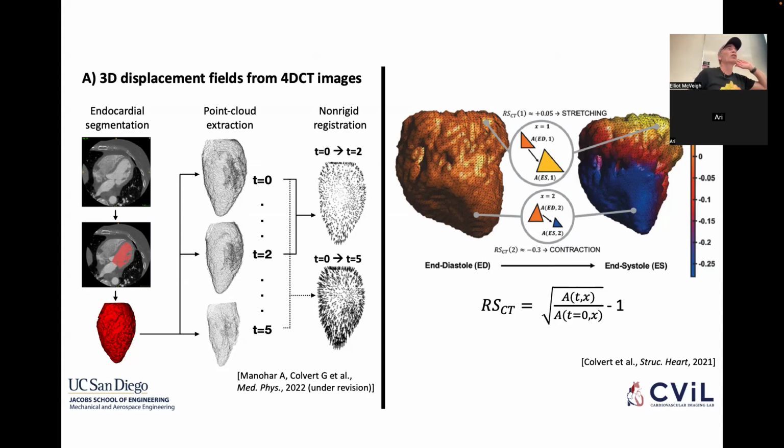It was, well, not 100% by hand, but the guidance was by hand. It was done in a chunk of software called ITK Snap. You start with balls, and then they grow, and you set a threshold for the gradient at which they'll stop. So the ball gets bigger and bigger inside the ventricle, it fills in all the corners, and then you stop it. You look and go, that looks good. You cut it off at different surfaces and say, okay, now that's my left ventricle. And you do that 20 times for each patient, because you have 20 time frames.